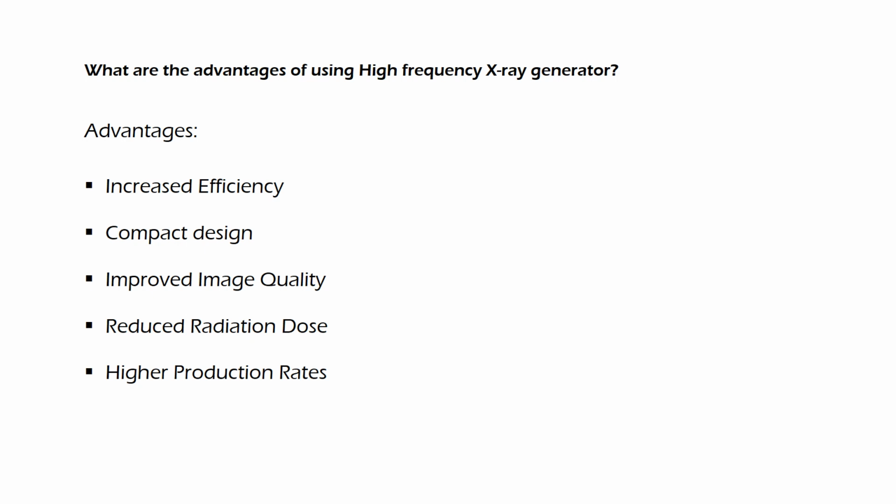In this introduction section of the tutorial, we have learnt about the converter, where it is used in the high-frequency X-ray machines, what is its function, and what are the advantages associated with its use. From here we move on to the fundamentals of the converter. The converter in the high-frequency X-ray generator is a so-called series resonant converter. The converter uses a series resonant circuit that consists of an inductive element, L, and a capacitive element, C, which are connected in series. The current and voltage characteristics of these elements will be discussed in this section.